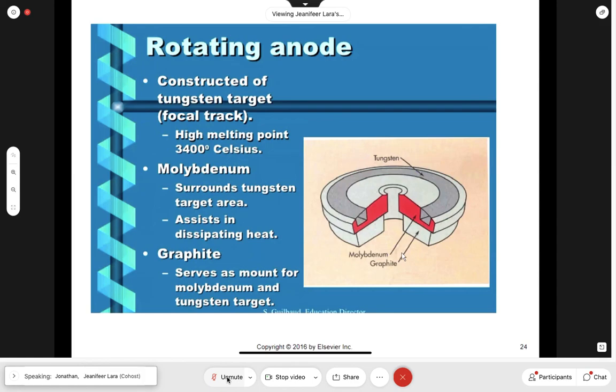A couple more questions. Sure. So phase one. You energize the anode and you energize the filament and focusing cup. Now, phase two, I'm assuming, is you cut off the energy from the focusing cup and the filament. Is there a second electrical charge going through the anode, which then makes that deposit? That's correct.